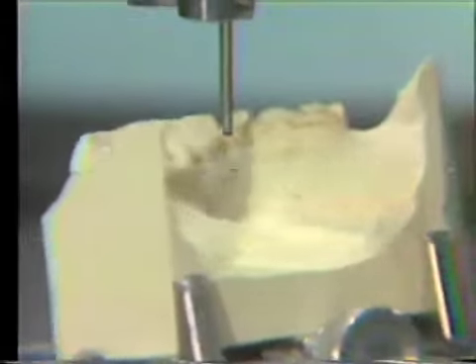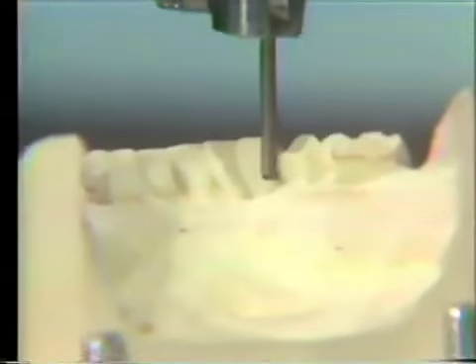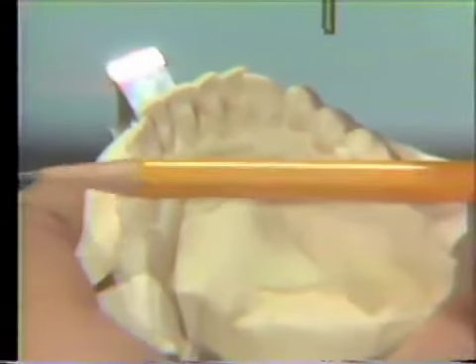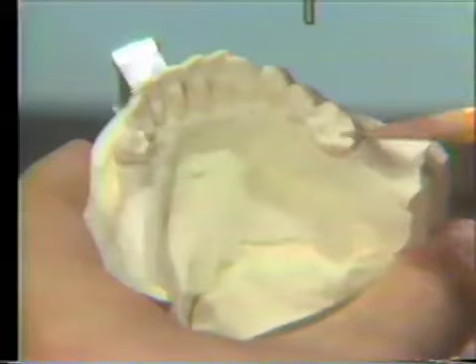Now, the other area we mentioned where the partial would have to be in contact with the teeth would be the potential indirect retainer area. In that indirect retainer area, let me just tilt this cast up a little bit. The potential indirect retainer area is the point that's furthest from a line going from the occlusal rest area to occlusal rest area.